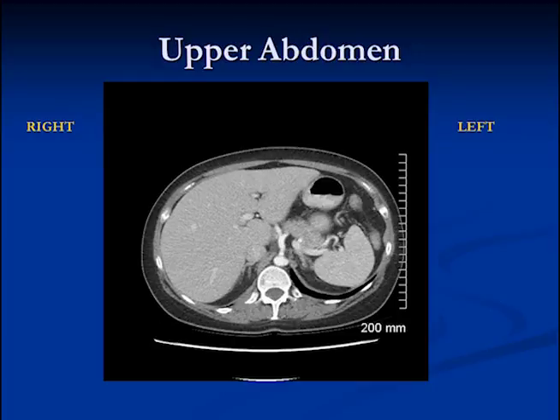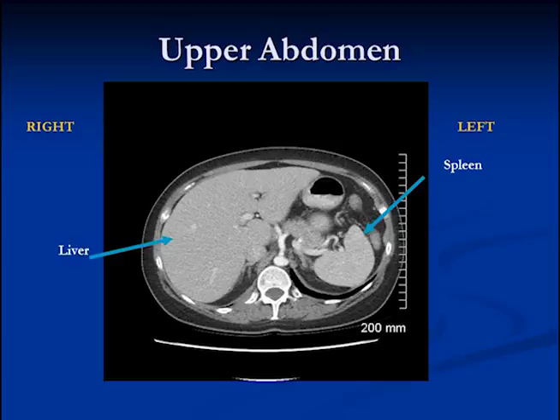This is a view of the upper abdomen. You can see on the right and left sides — this is the liver over here, and we have the spleen on the other side. When you're looking at a CT scan, it's like looking from the feet up through the head, so everything is oriented that way, and the right side is to your left and the left side is to your right.